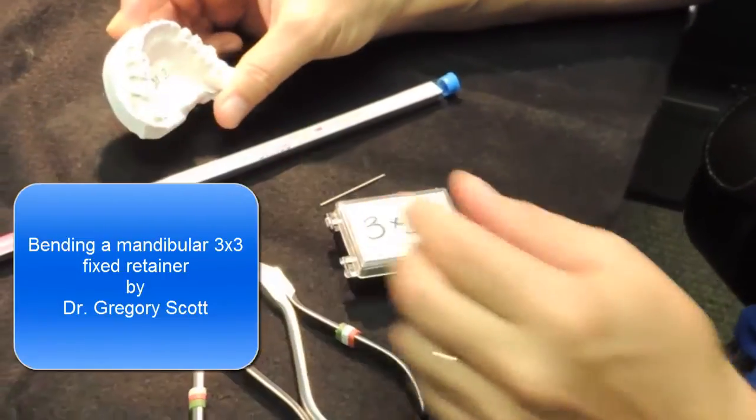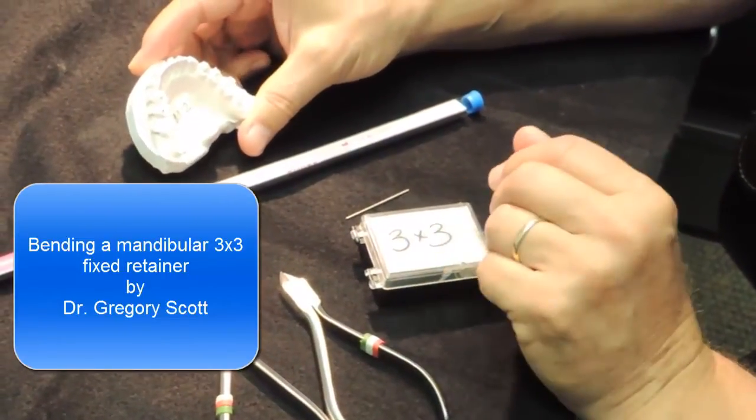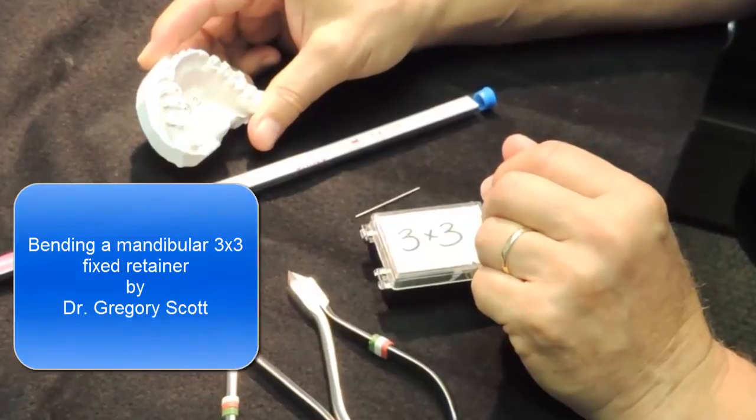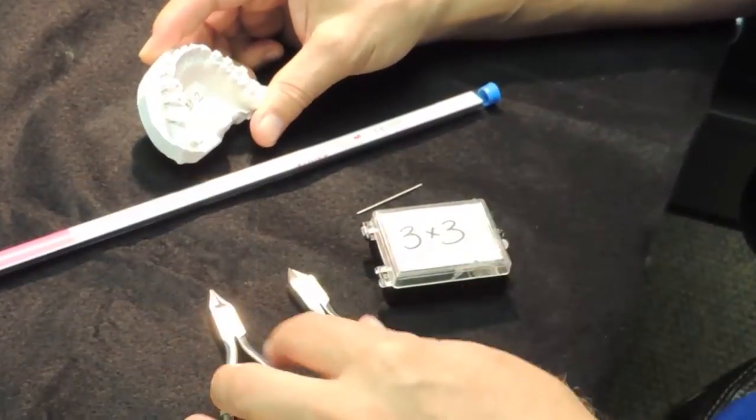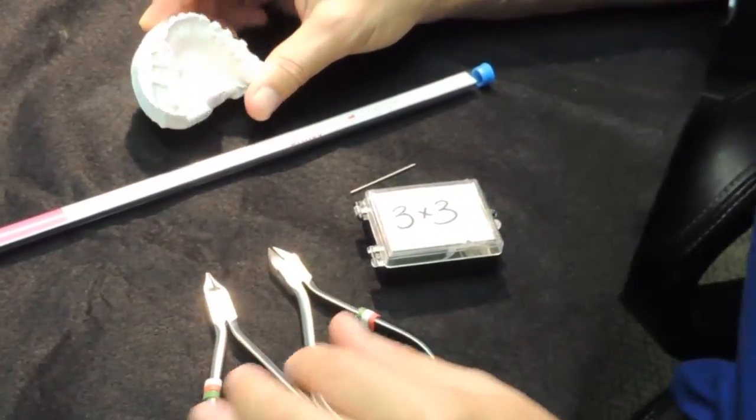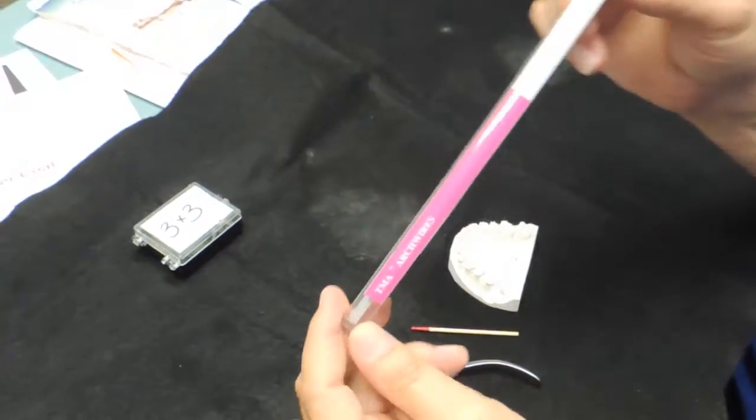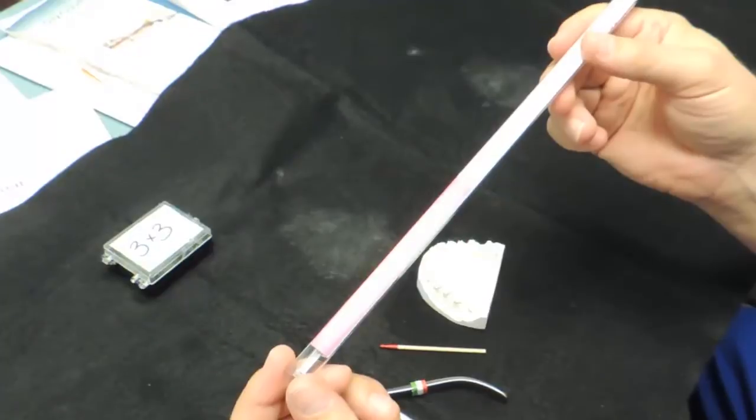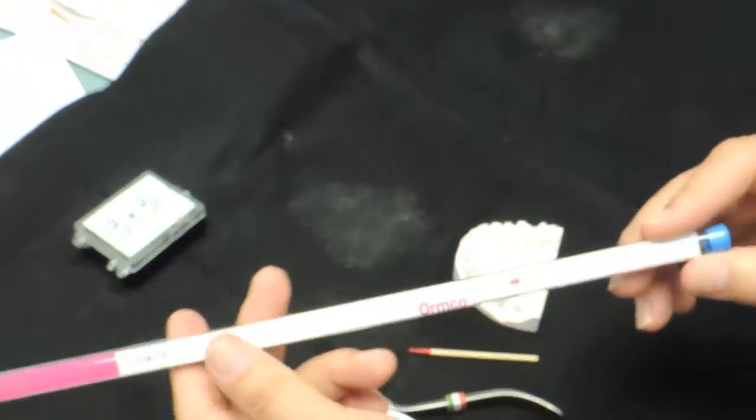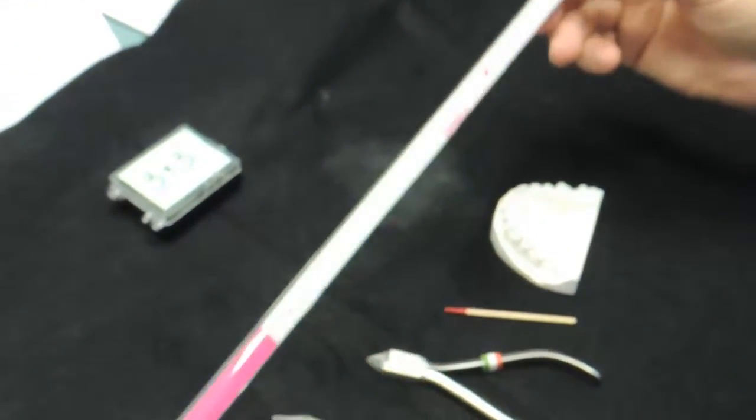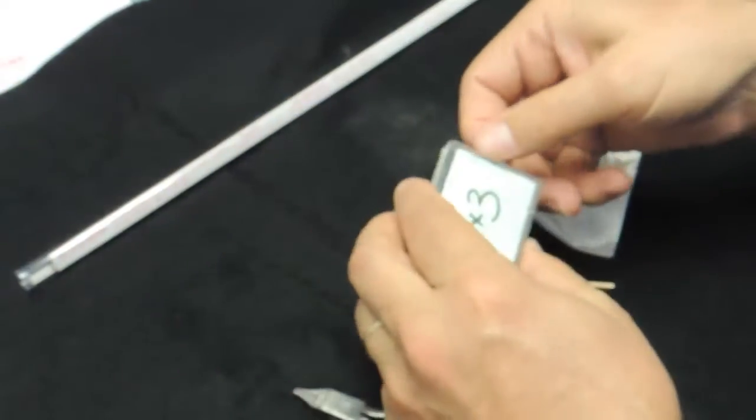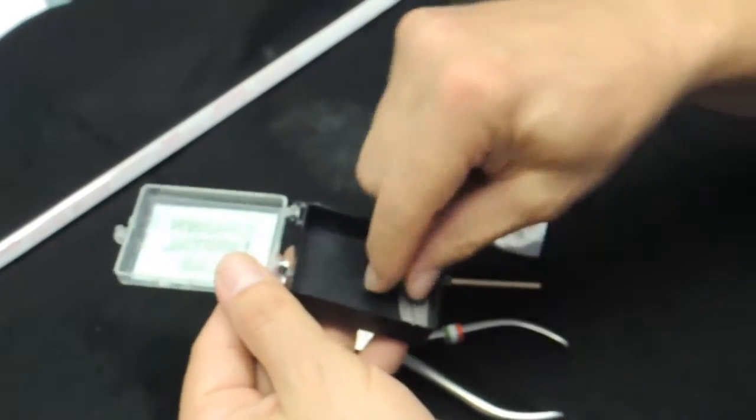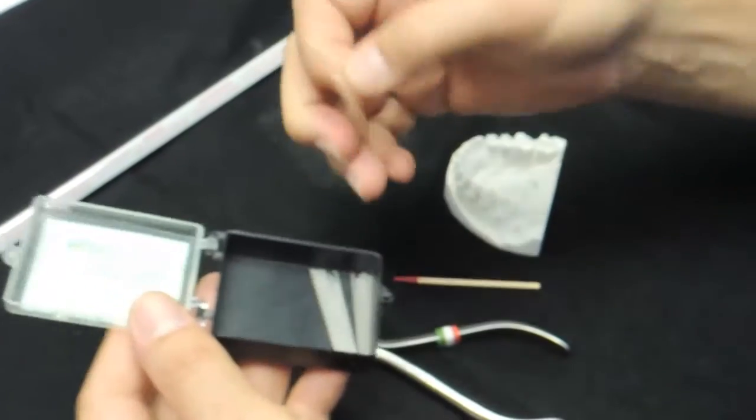This is a short instructional video on how to bend a lower 3x3 fixed retainer bonded only to the cuspids. For that we use TMA arch wire. It's an 032 TMA arch wire that we get from Ormco in long lengths. We cut those lengths just to have a supply, cut them short and keep them on hand.